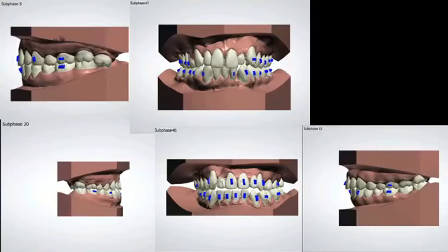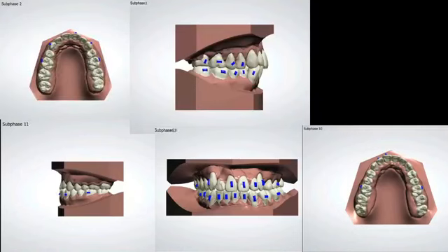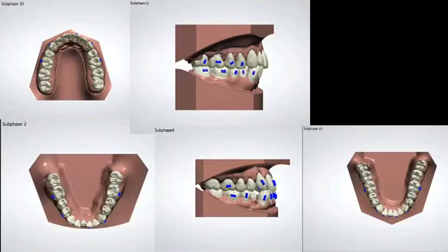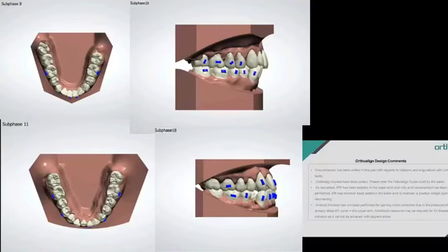So this is what you will receive as a treatment video. On the top left hand corner of the videos, you can see the numbers. The numbers that you see there are the number of stages. As every stage goes up, you will see that the numbers go up as well. So you can see all the stages slowly climbing higher and higher.